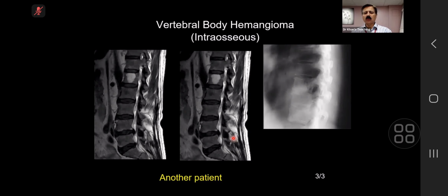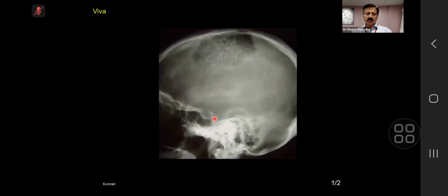I'm not going into the world of atypical hemangiomas, which has got many gray areas, and I don't think that's for FRCR 2B. That's beyond. So anything high signal on T1 as well as T2, it's good news. Yes, please.